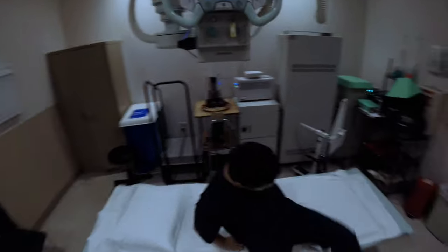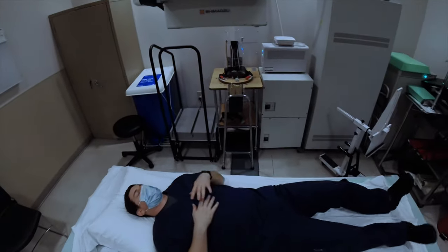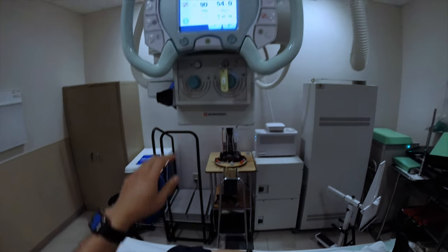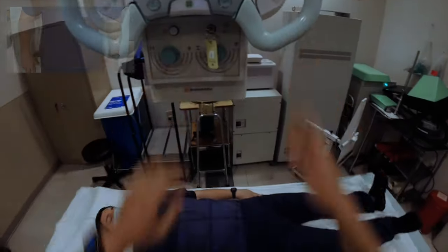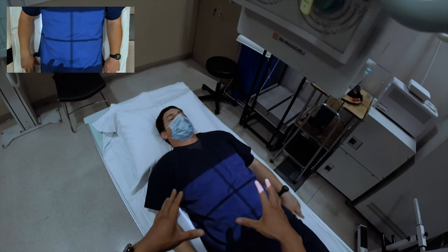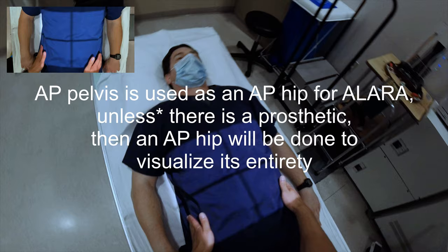So how long have you been having your pain for? I'd say severe pain probably last couple days. Did you fall? Was it caused by injury to your knowledge? Yeah, I kind of fell. Caught my right hip. Uh-oh. All right. Any surgeries, any previous injuries, anything like that? No. All right, so we're going to take a picture of your full pelvis and then just of that hip, okay? Okay. So I'm just going to feel the top of your hip here.